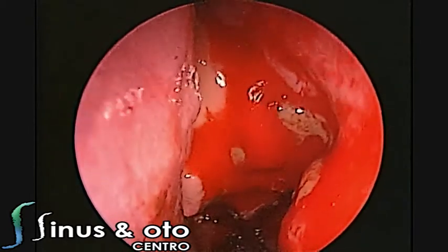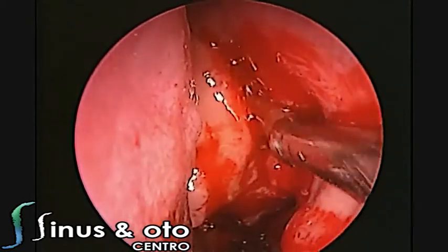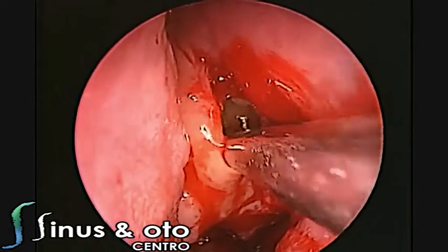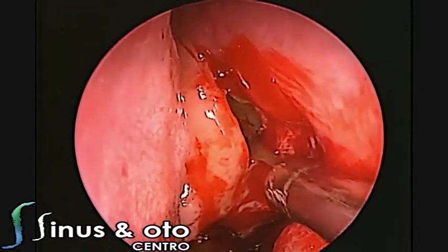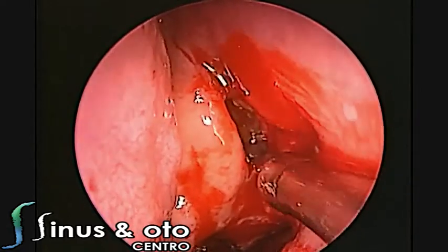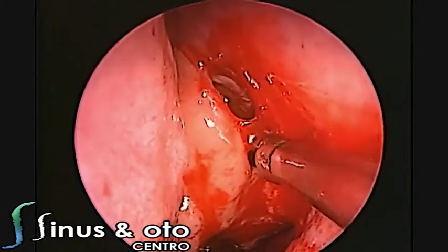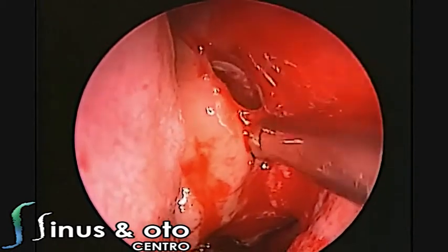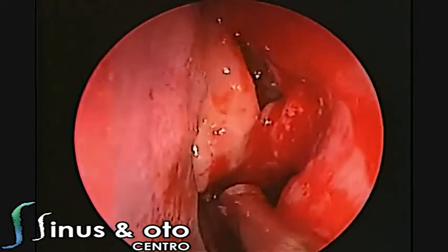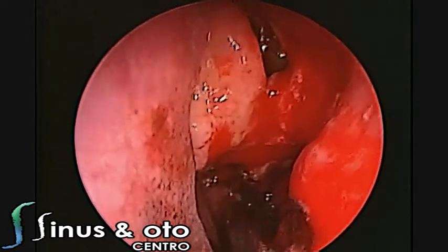We open the mucocele with a Freer elevator, following the orbit. You have to remember that the lamina papyracea is eroded, so you have to be careful about opening this — not to go inside the orbit. But since we have the maxillary sinus as a landmark to the orbit, we can see the orbital floor in the maxillary sinus, giving us a very nice, safe way to open this lesion.